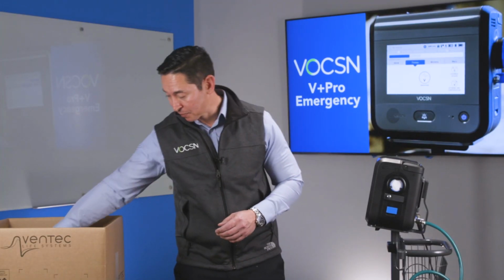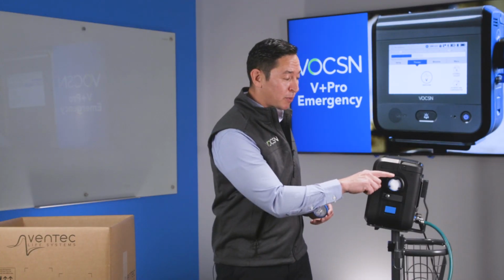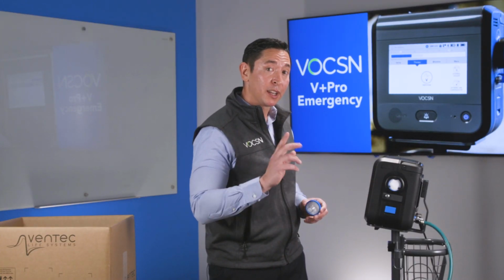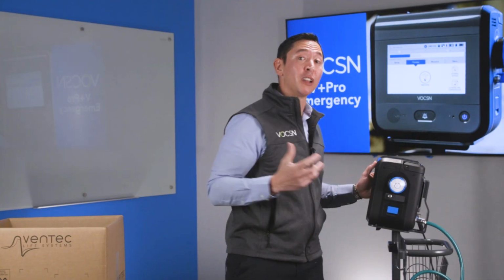What I'm going to grab in the box is our external bacteria filter. Single patient use, follow whatever your institution's protocols are for changing this. There's actually a little notch right here, and there's actually a notch right up here. I'm going to line those two notches up and then twist to the right. You'll feel it lock into place.